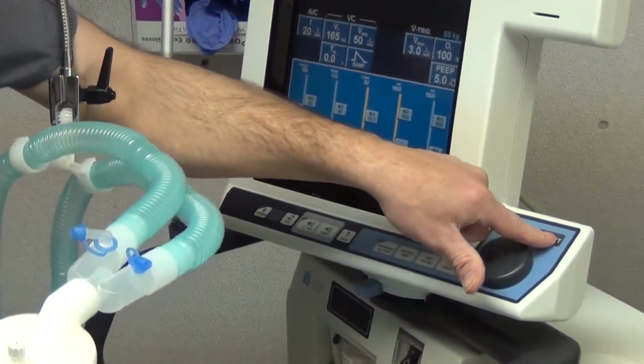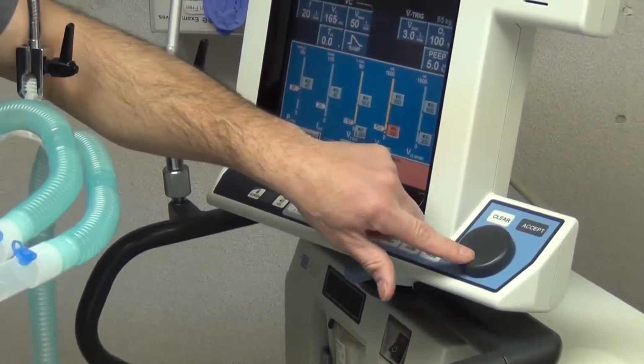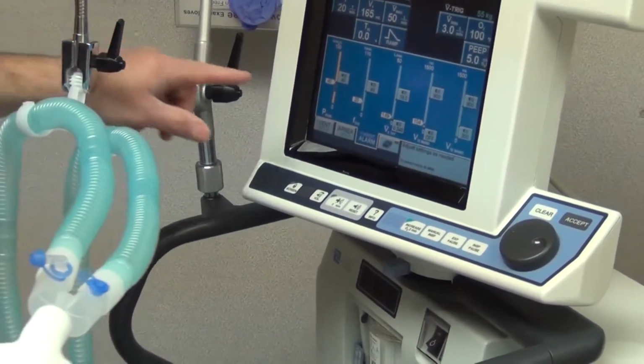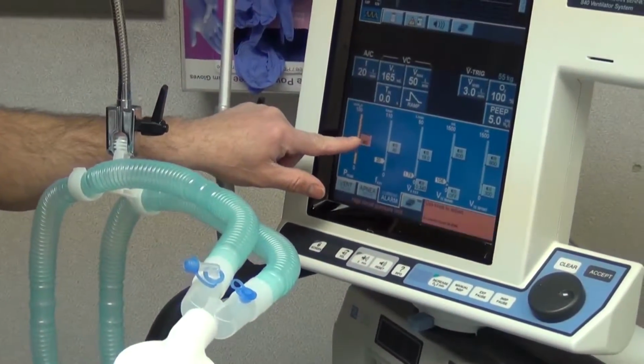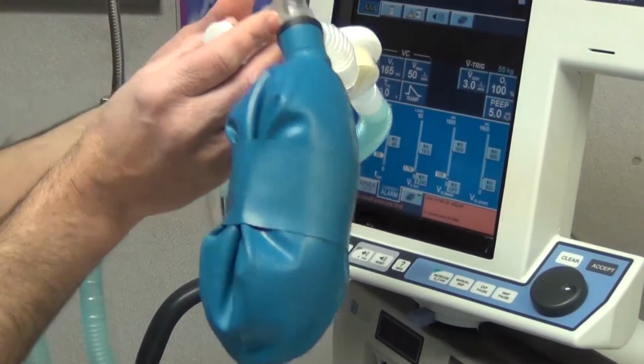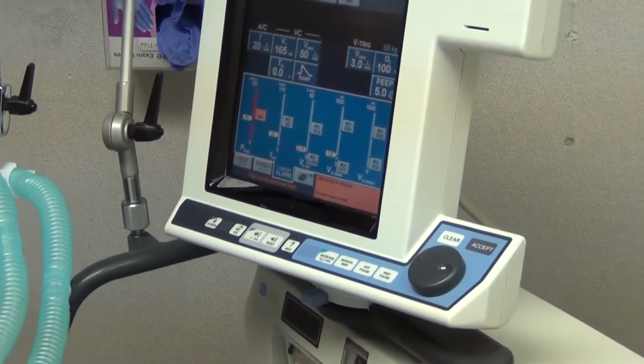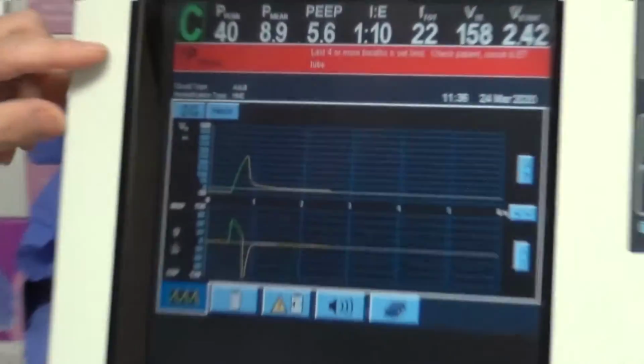So I'm going to adjust these alarms also. And notice I can do that after I'm connected. You can always make changes. And the peak pressure is going to be high also because this is such a small thing to ventilate. Notice your alarm at the top. Peak pressure.